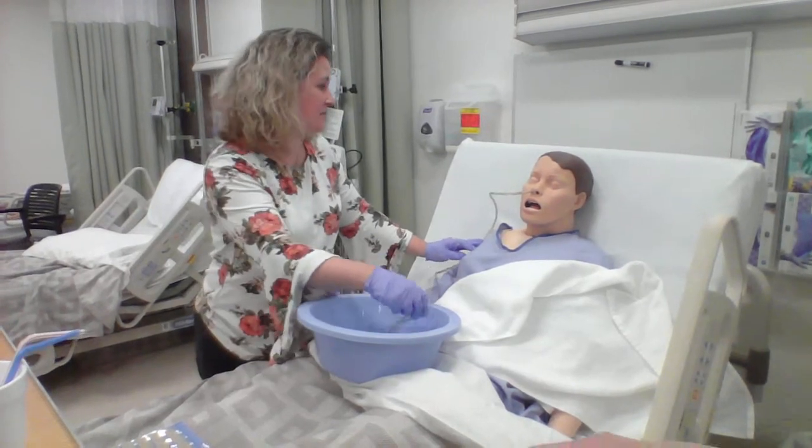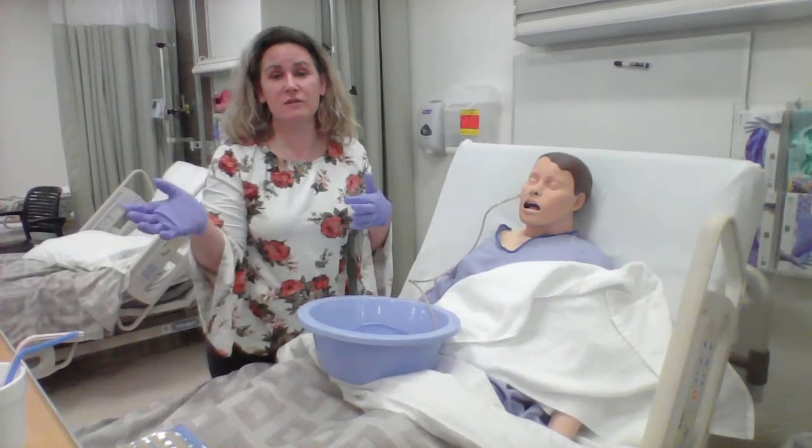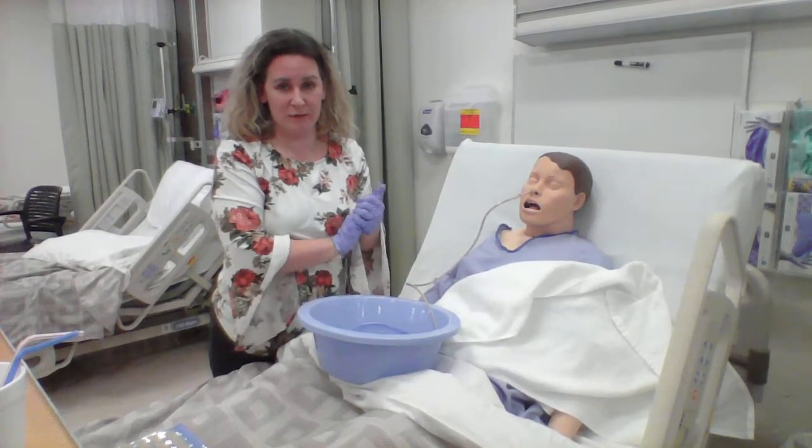Do you have any questions? Is that okay? Patient states that it is. So we would then take them to X-ray and verify that it's in the right placement.